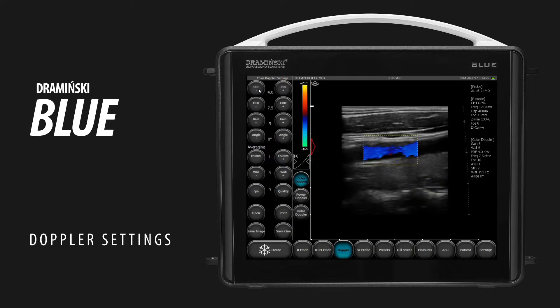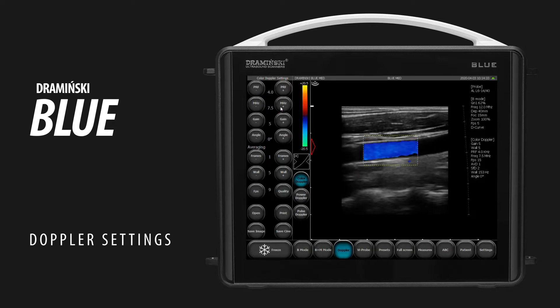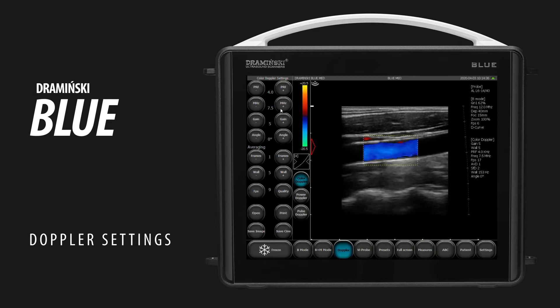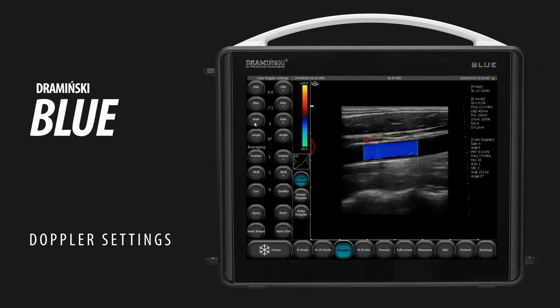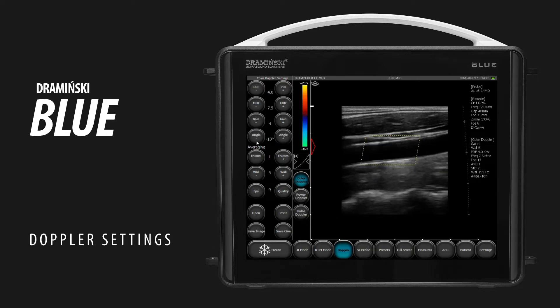Use MHz to change frequency. Note that it is fixed for the AL-L6-14 Pro. Use the Gain buttons to adjust color gain. Use the Angle buttons to move the color box.